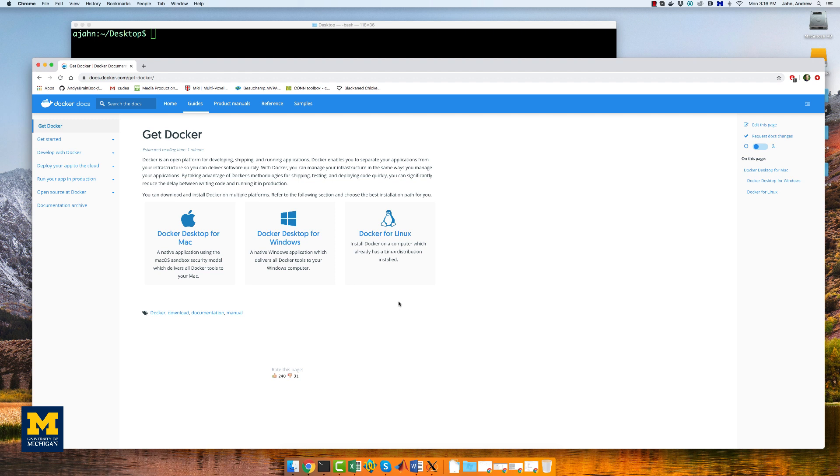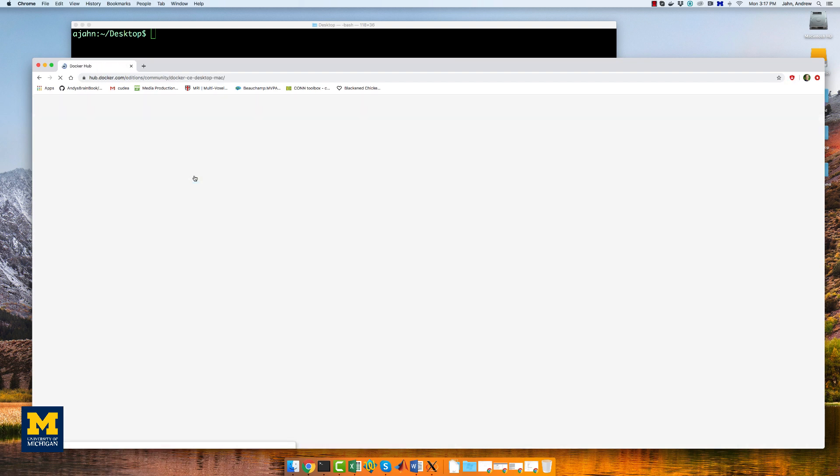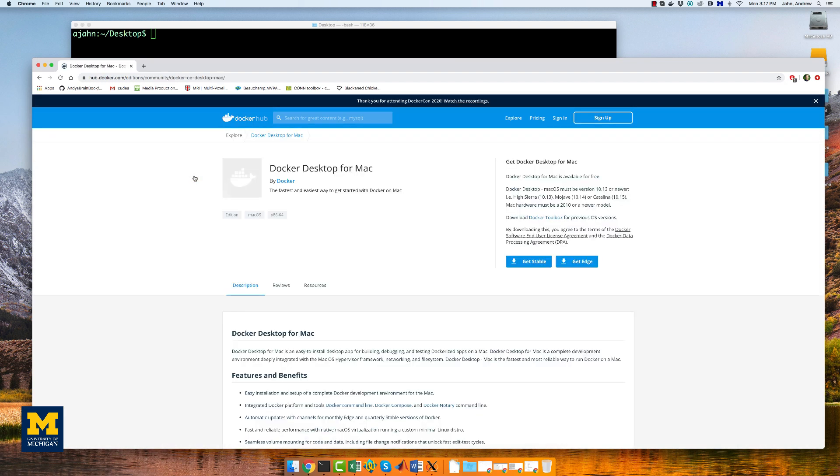Go to this webpage to download the version of Docker for your system, in my case, for Macintosh. This will take a little while, so at this point, I'm going to fade out once it starts to download, and come back when it has finished.